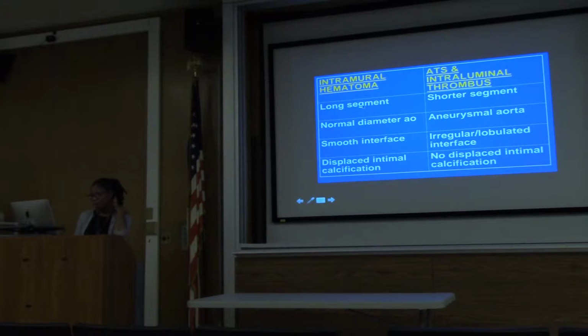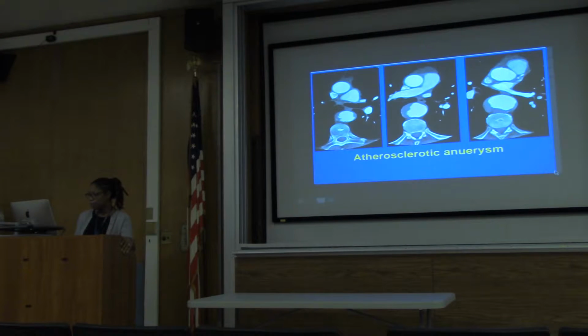But in the interest of time, I know you guys have to go somewhere, we can just skip through these. The point is that you should do the pre-contrast study because you can't always tell the difference between them.